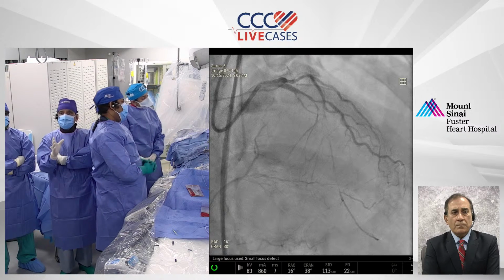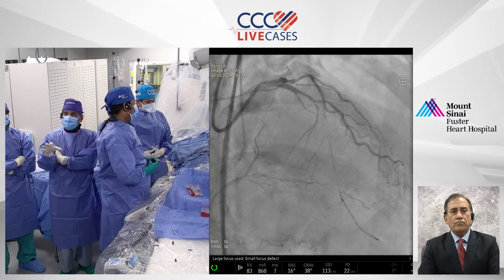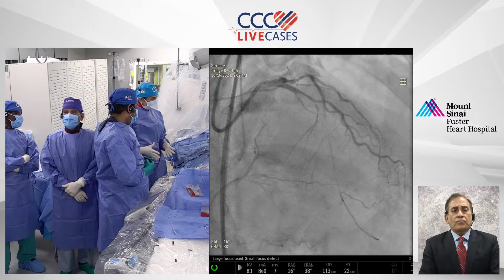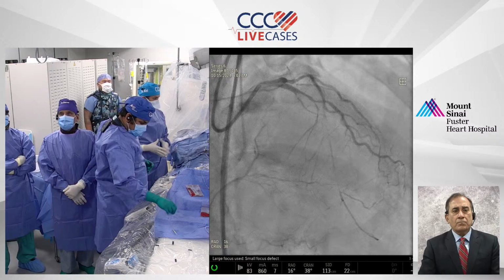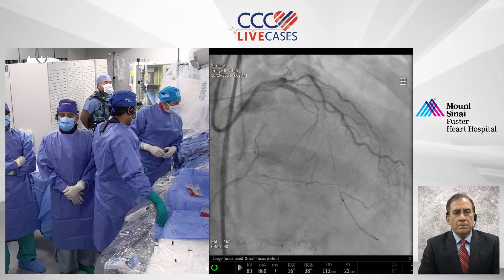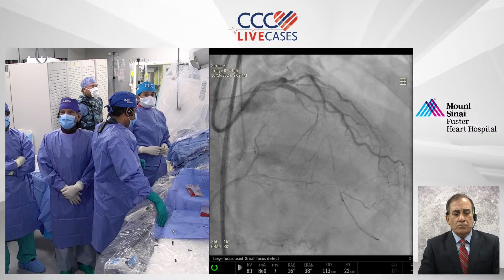So these are all progressions of the lesions in both the RCA and LAD from 6 years ago. This is despite his LDL around 60. Actually, LDL today is even in a good range. LDL is 55 now. Of course, HDL is 39, which is very tough. There is no treatment for it unless you do a lot of exercise. But this case, with almost no CAD risk factors, or minimal I should say, has a progression of disease and silent progression of this LAD.